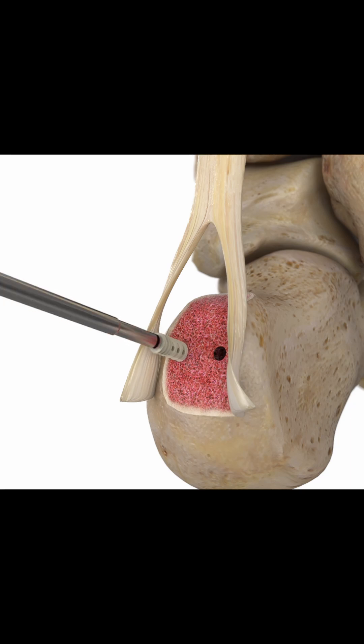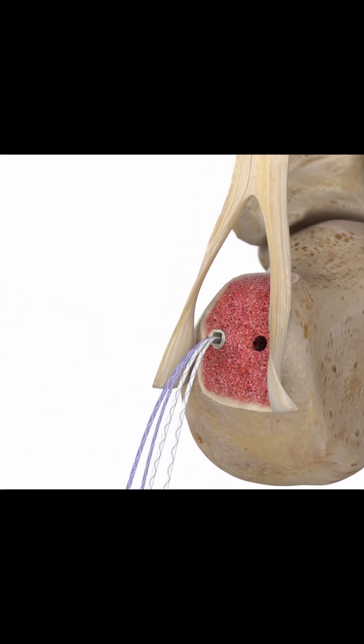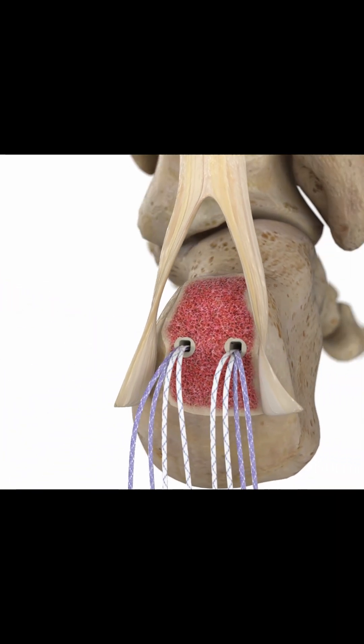The Alphavent anchor is screwed into one side. Repeat the step, placing two anchors in the proximal rows.